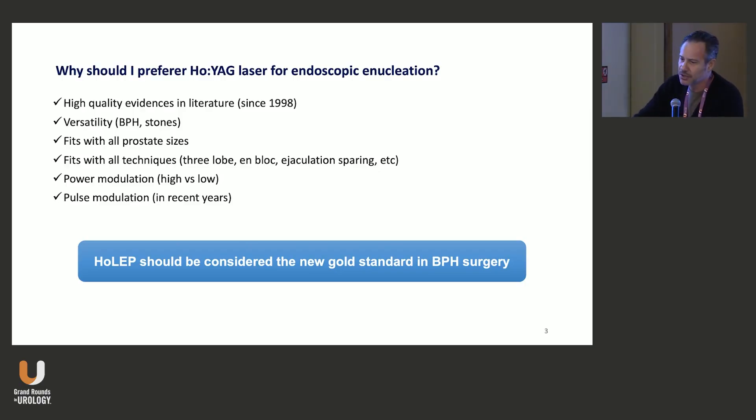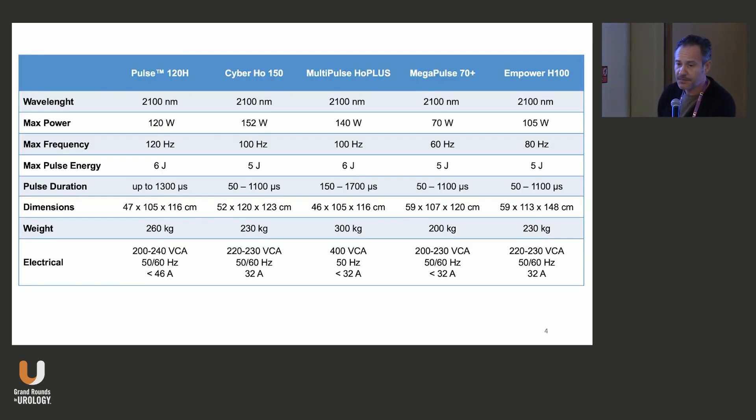You can also do the ejaculation-sparing technique if the patient requires it and if the anatomy of the gland may allow sparing ejaculation. You can have power modulation, high versus low. I basically prefer low power, because in my mind the less energy we deliver to the tissue, the less inflammation we may cause right after, and so we're going to have less symptoms after the procedure. And with new lasers, we have introduced pulse modulation.